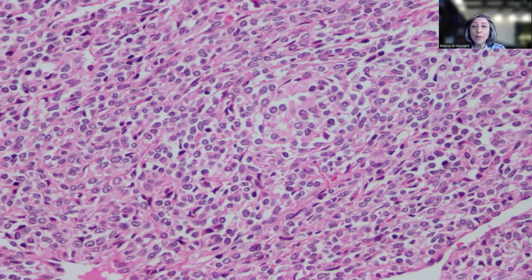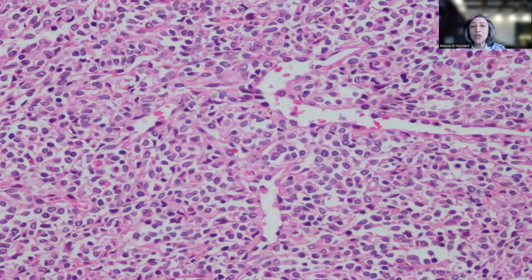stromal sarcoma tumors. The tumor cells are growing in sheets. They have oval nuclei, inconspicuous nucleoli, and acidophilic cytoplasm. Sometimes, as I'll be showing you now, they even give a resemblance to rhabdoid tumors. There are no easily identifiable mitotic figures or evidence of necrosis.